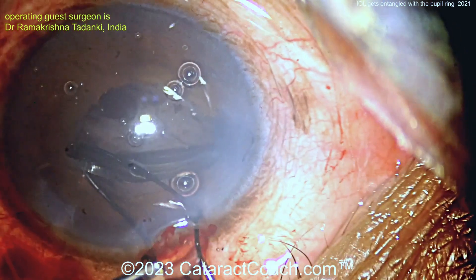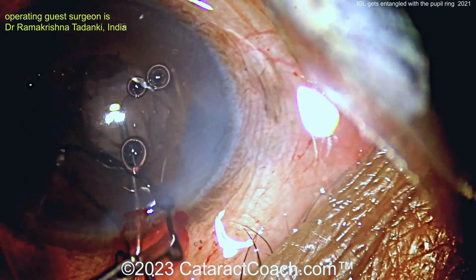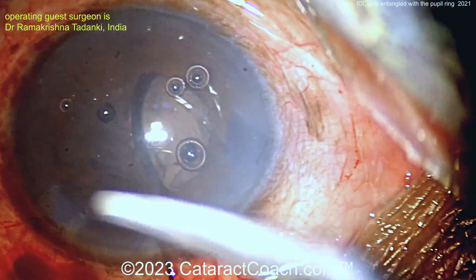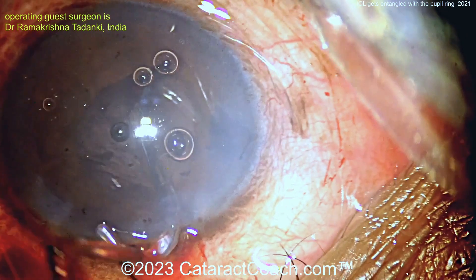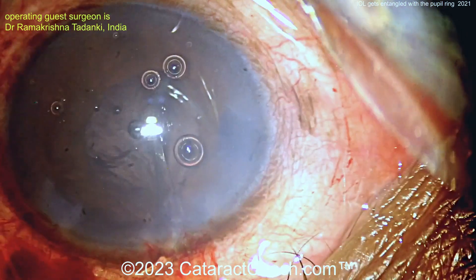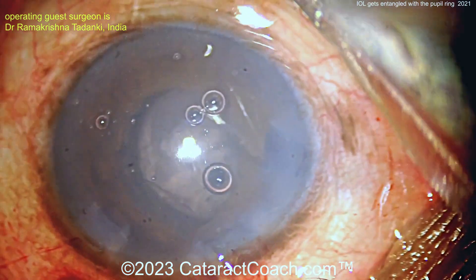Here's where you just get that lens put back into position. Push it — that's it. Get that in the eye. And now it's coming off finally off the trailing haptic. Go inside the eye and move that haptic. You could just yank it. There you go — got to be careful here. Nice save. Now more viscoelastic. The key here is make sure the IOL goes fully into the capsular bag.